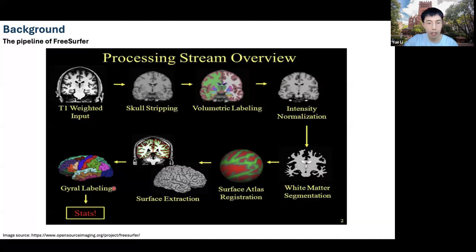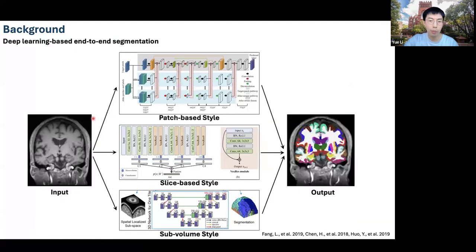This is a complex and time-consuming pipeline. So besides FreeSurfer, we know in the past 10 years, deep learning models have been widely used in medical imaging segmentation. The authors of this paper divided them into 3 categories, including the patch-based style, the slice-based style, or subvolume-based style.